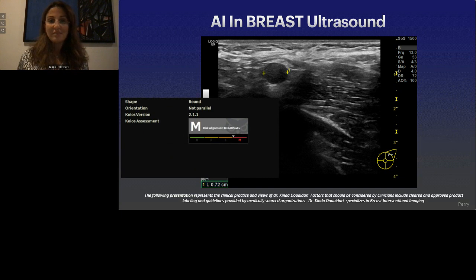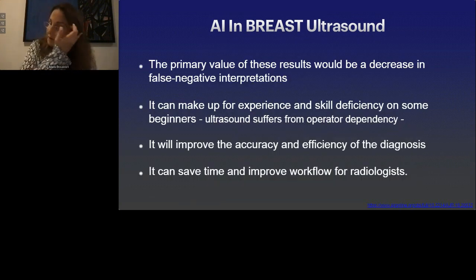I was very surprised. I can understand with CAD, for me, I did the biopsy because of the clinical history, but it didn't know the clinical history. So obviously it's analyzing features beyond our eye recognition, our human recognition. So it was, of course, an invasive cancer. It was a recurrence. So I believe AI in ultrasound works amazingly. Sometimes it's wrong, sometimes it's right.